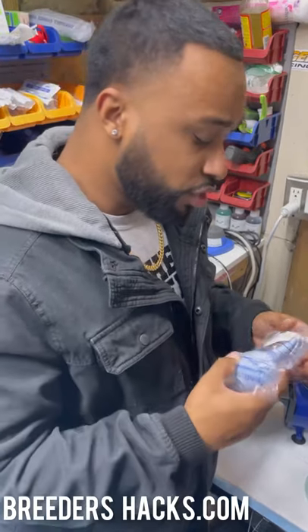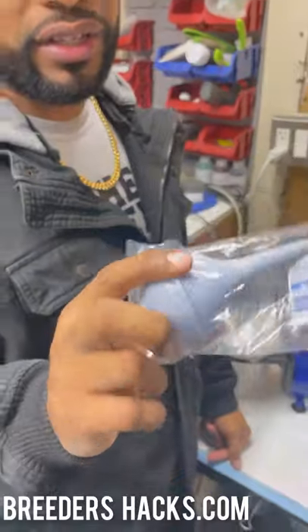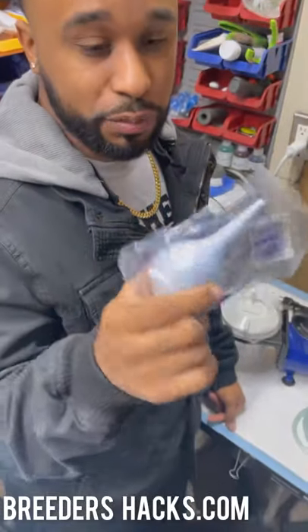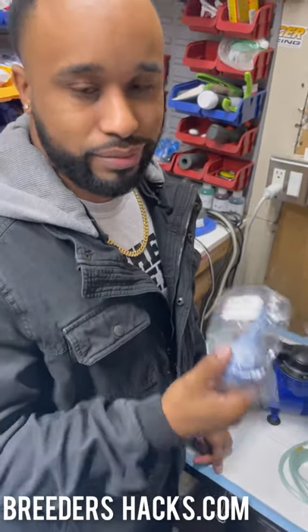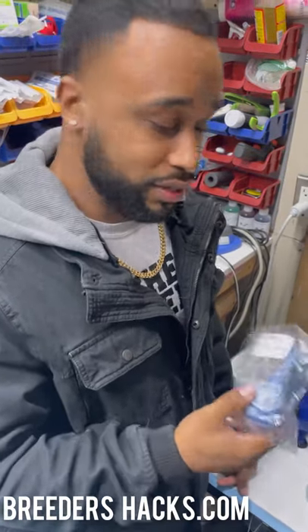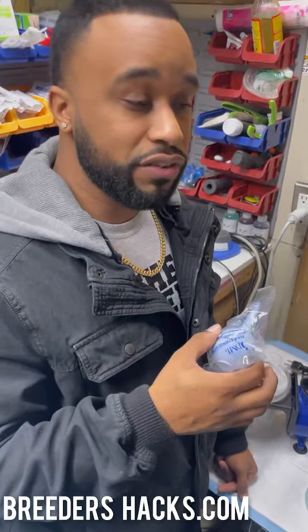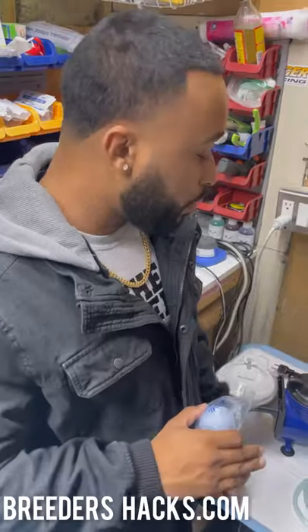This is the old-school way of doing it. We do include these handheld aspirators in our puppy care kits. They work decently — if you don't have anything else, I'd recommend using one. But if you want something truly effective and efficient that will eliminate mucus and take it right out of the puppy, this is what I recommend.